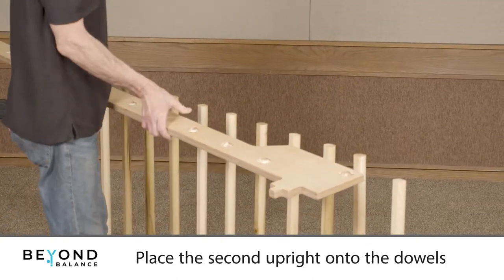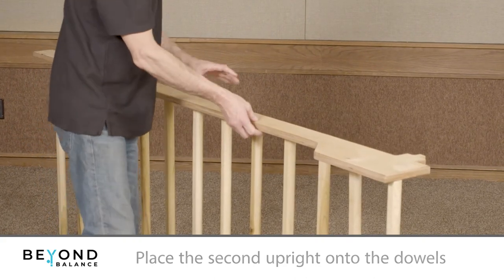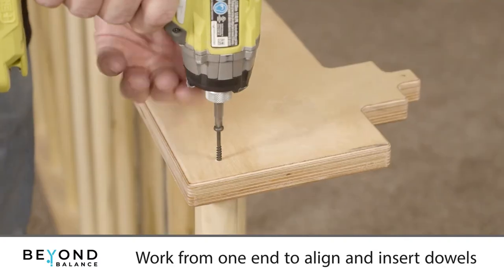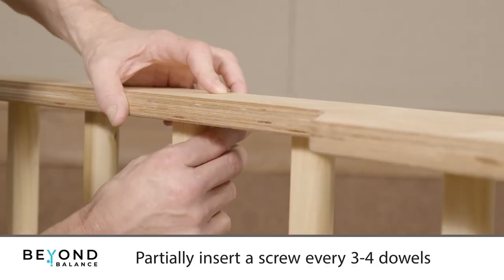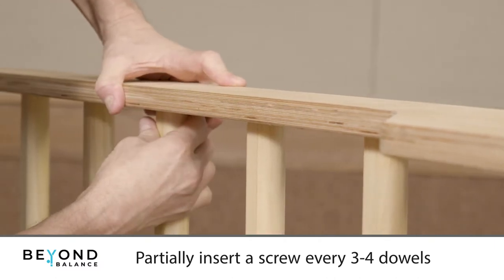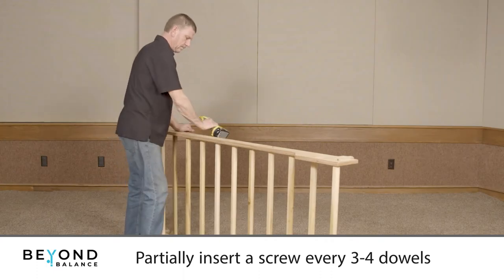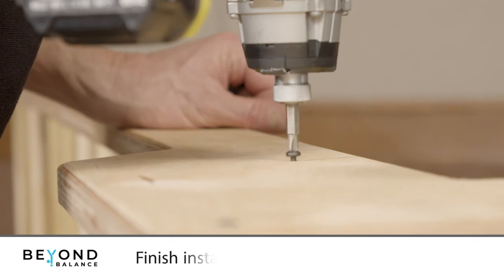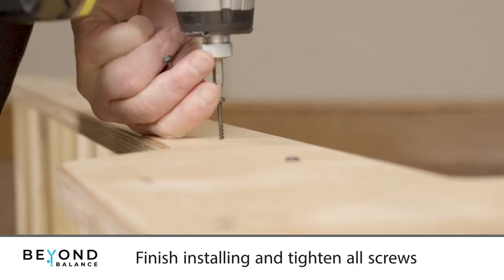Place the second upright onto the dowels. Working from one end, align and insert a few rungs at a time. Partially insert a screw every three to four rungs to hold them in place until all dowels are aligned. Then finish installing all screws and tighten any partially inserted screws.